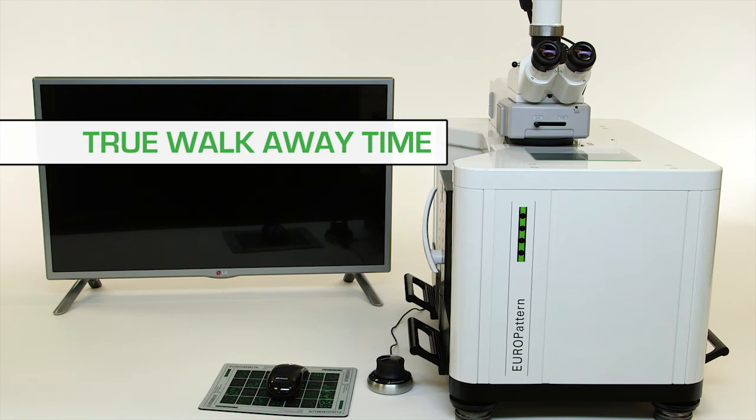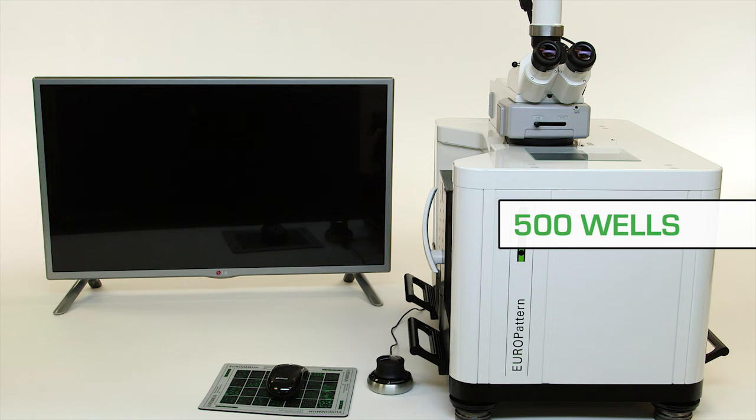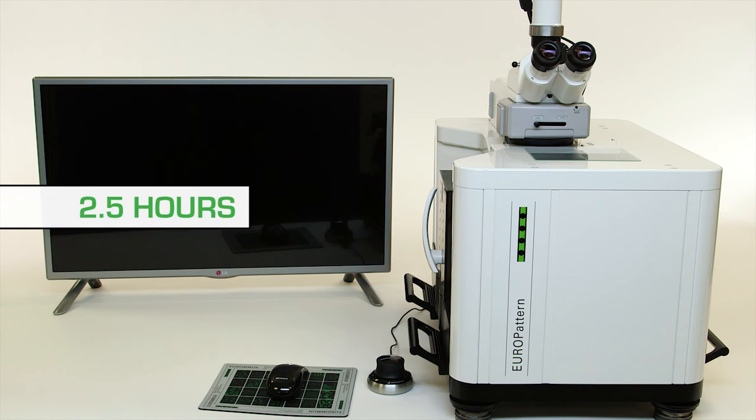True walk-away time is realized through the Europattern's ability to process up to 500 wells in a single run in two and a half hours.